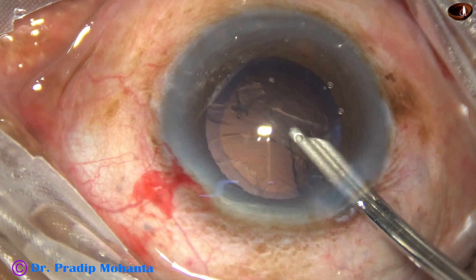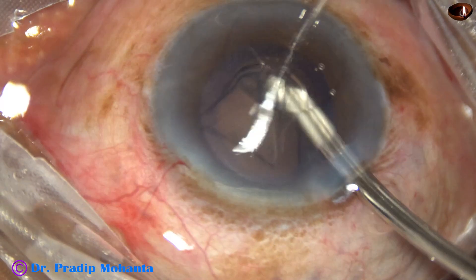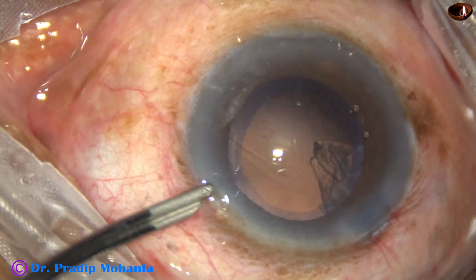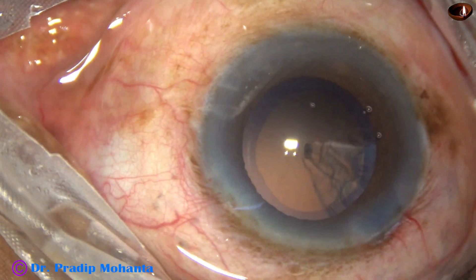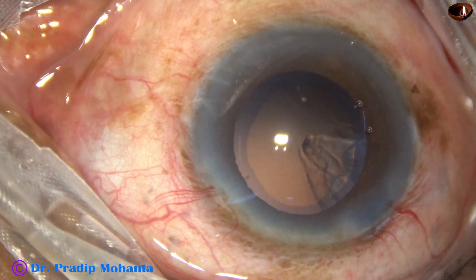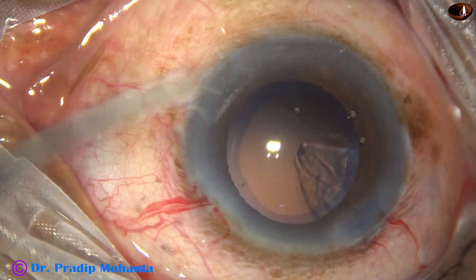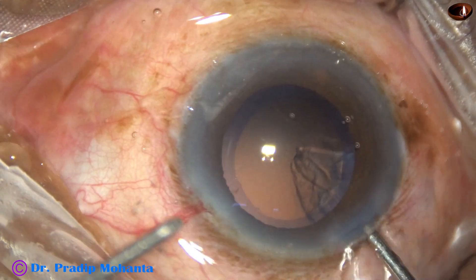And now, the side port is small, so I am going to use bimanual irrigation aspiration for removal of this cortex.